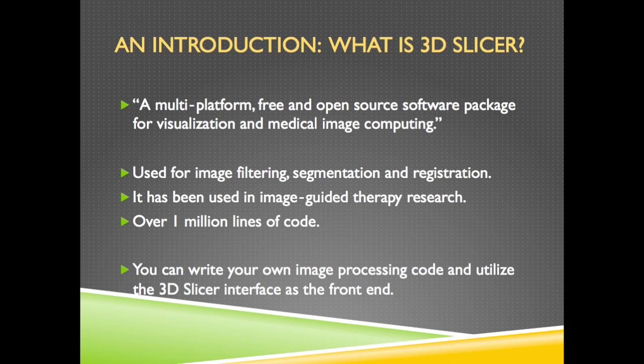It's used for image filtering, segmentation, registration. If you don't know about segmentation and registration, don't worry, I will show you what segmentation is, and we will learn what registration is. It has over 1 million lines of code. It started as a master thesis. You can write your own code and then utilize the 3D Slicer as the front end.